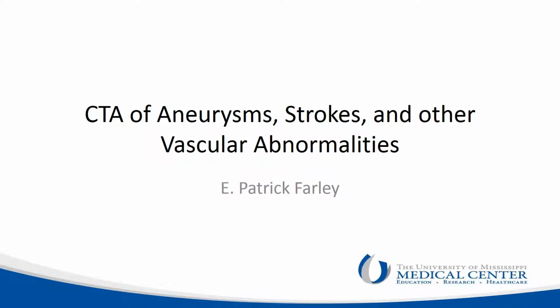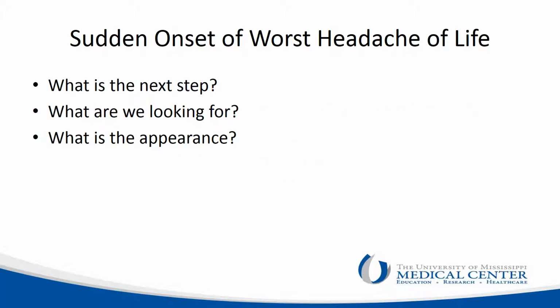This presentation will be on CTA at the University of Mississippi Medical Center, though it should apply elsewhere as well. We're going to focus on obtaining the CTA and some of the limitations and advantages.